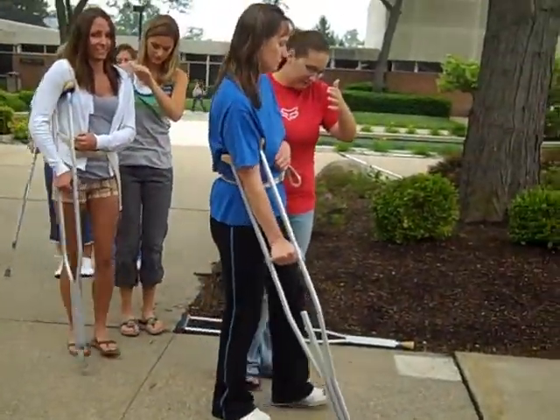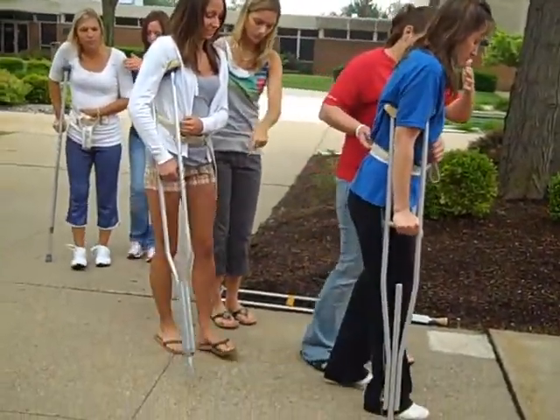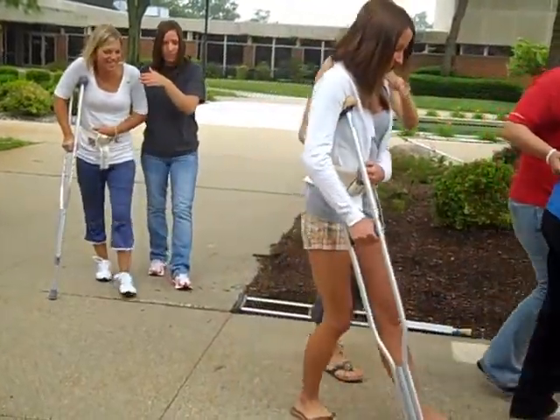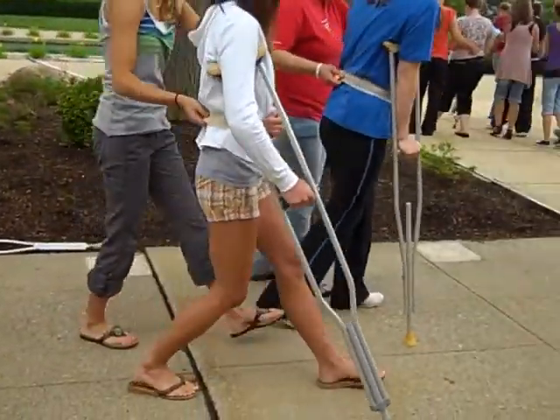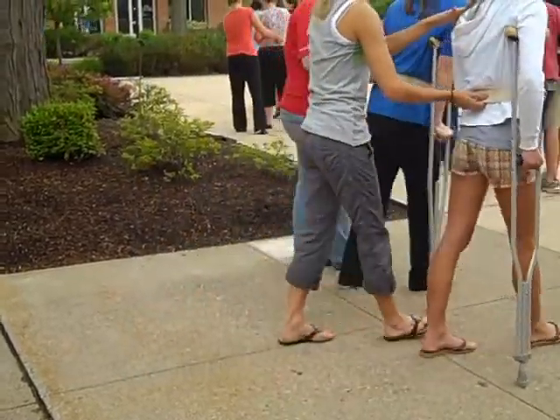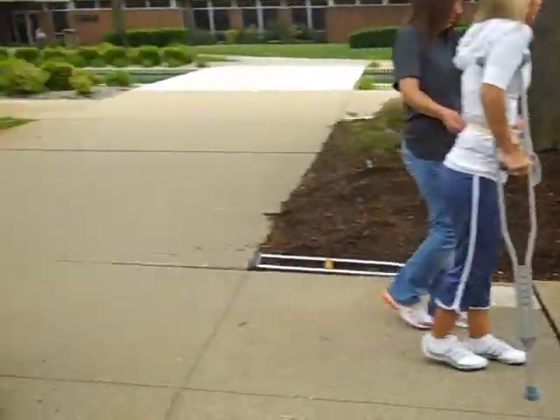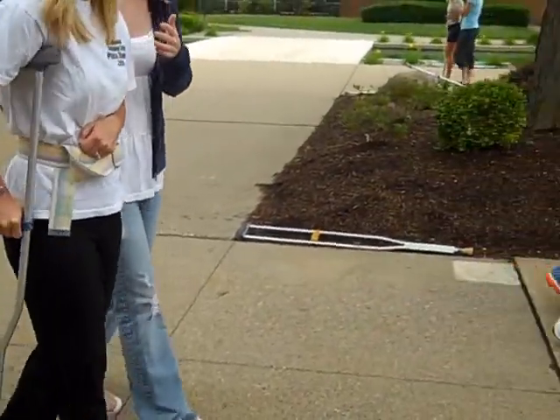Now go ahead and take that patient to the final progression, if you haven't already. Crutch and foot two, and step through with the strong leg. Lovely.